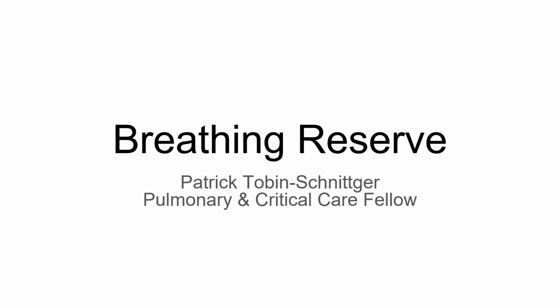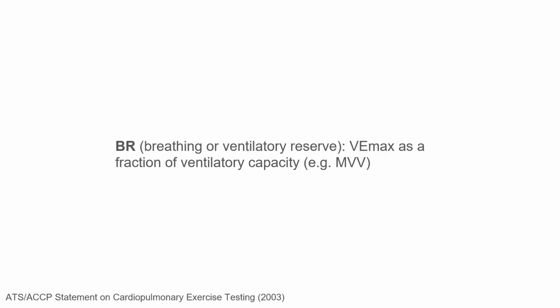This video is on breathing reserve. So our breathing reserve, or ventilatory reserve, is the expression of our maximal minute ventilation as a fraction of our ventilatory capacity, and we typically use our maximal voluntary ventilation as a measure of our ventilatory capacity.